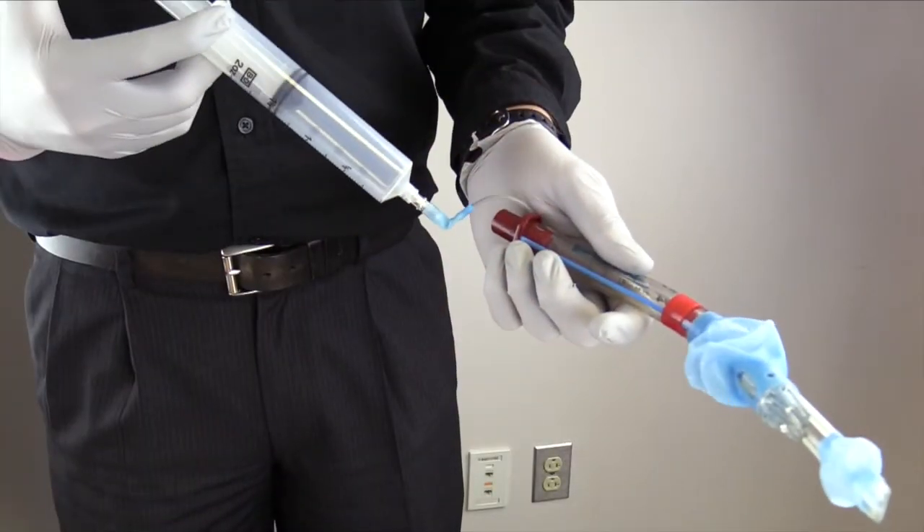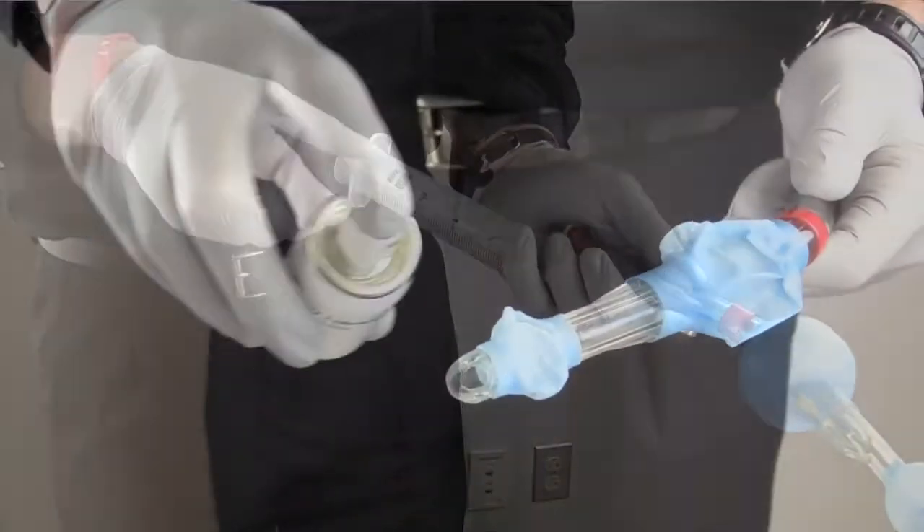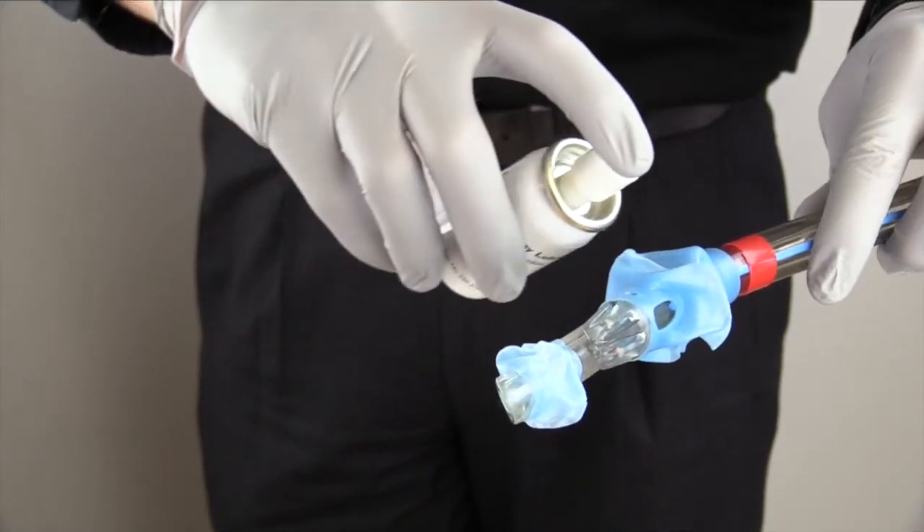I will inspect the packaging of the airway device for tears, and if none are found, I can remove the device and inflate the cuffs to ensure they hold air. Before inserting the device, I will apply lubrication to the distal tip and ask my partner to stop ventilating and remove the OPA.